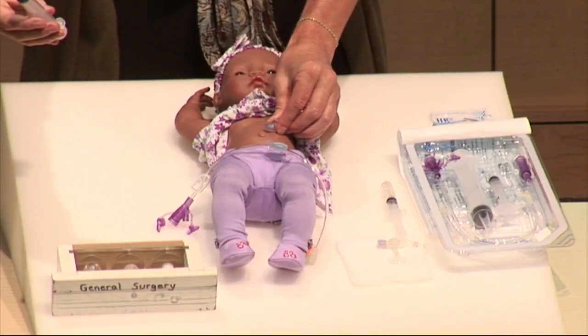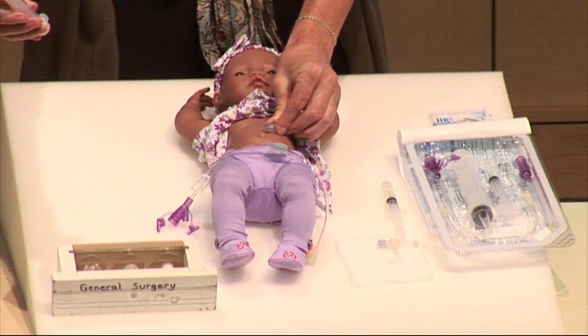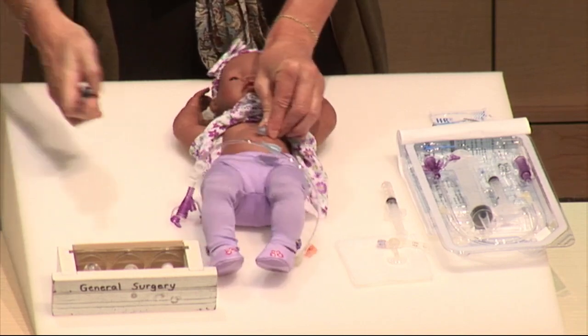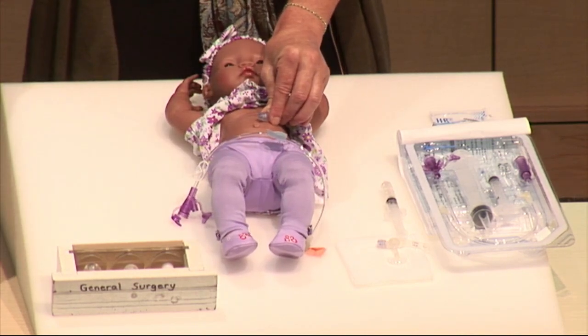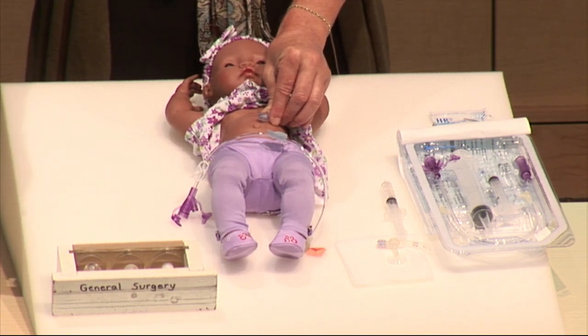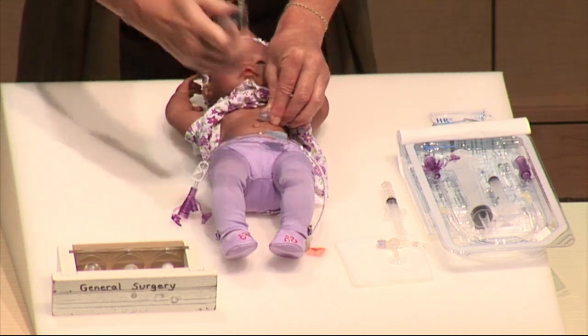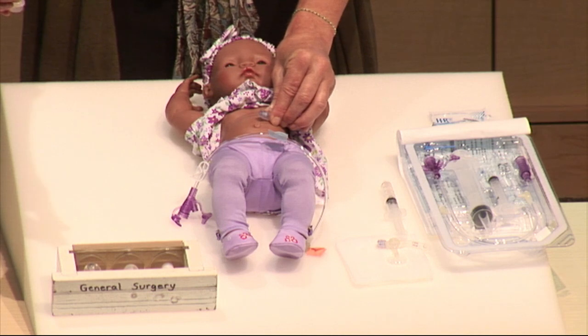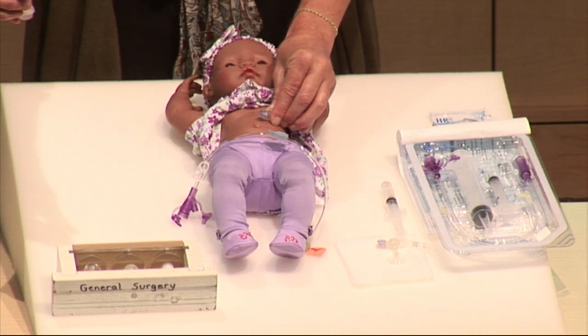So I'm going to take an empty syringe in my dominant hand, and I'm going to grab onto the base of the tube with my supporting hand. Now, it doesn't matter how wiggly or uncooperative this kid is being. I can do this by myself, and I assure parents that they can too. There are some super wild kids, and sometimes you have to lay your body down over their legs so that they aren't kicking so much, but it really is usually possible to do this by yourself.